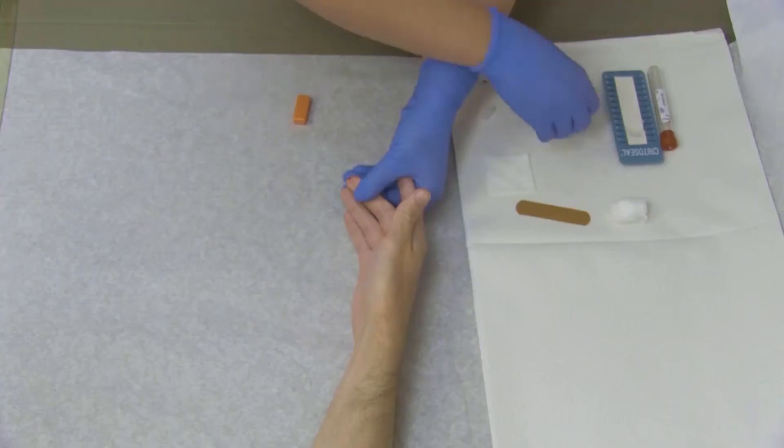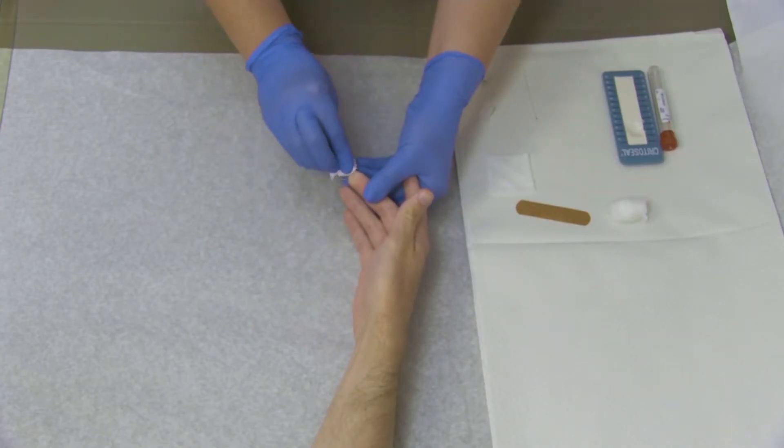Discard the lancet into the sharps container. The first drop of blood is wiped away with a dry, sterile gauze.